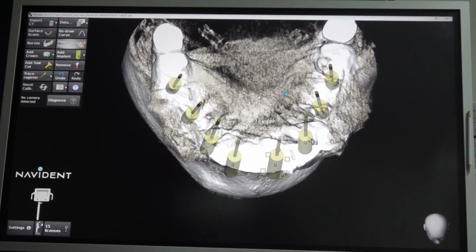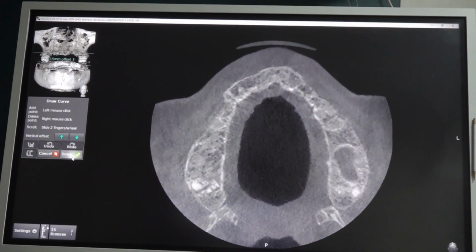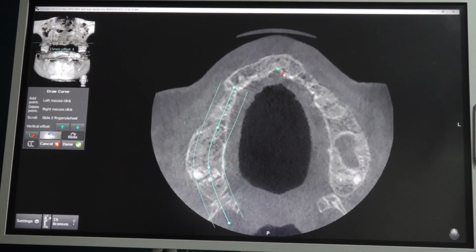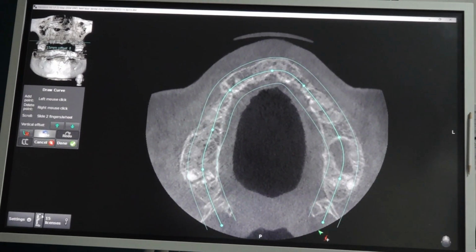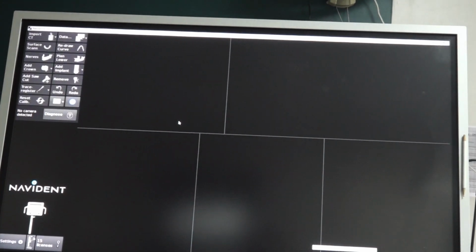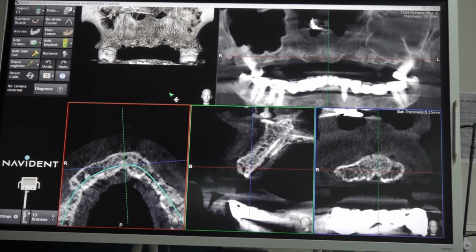So now you understand where to select compressive, where to select basal. Some simple principles are there. One principle is, if you use basal, the apical threads should engage in a good cortical. Right? That is one principle. So wherever you are getting good cortical, you can place a basal implant. So that means in the mesial root of 6, basal is not an ideal choice most of the time, because there is no undercut there, there is no mylohyoid ridge there.